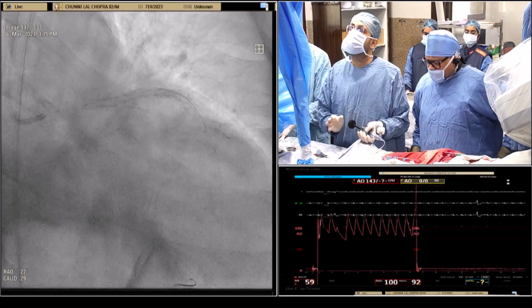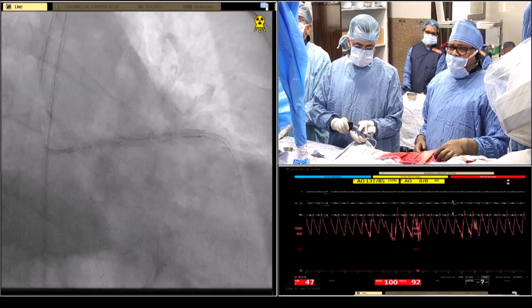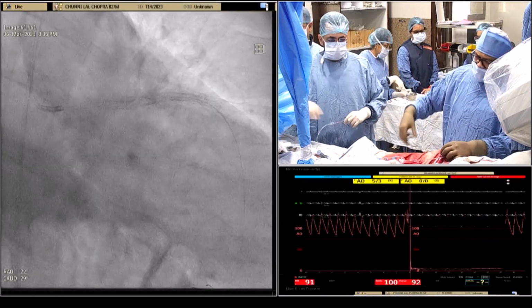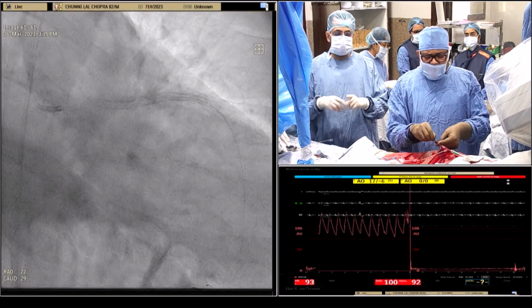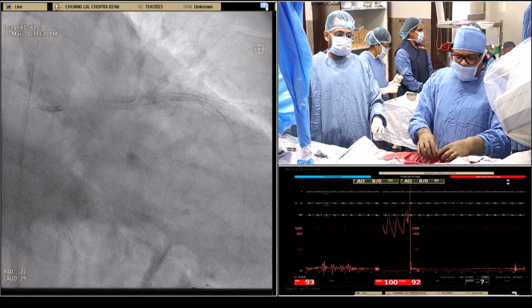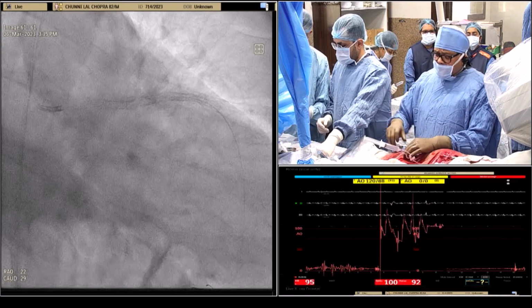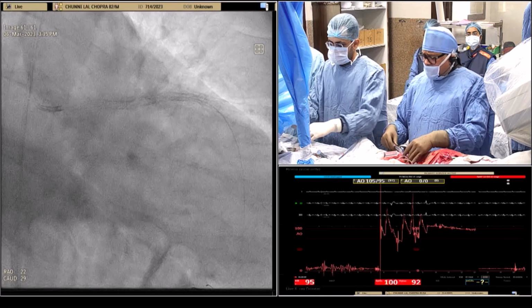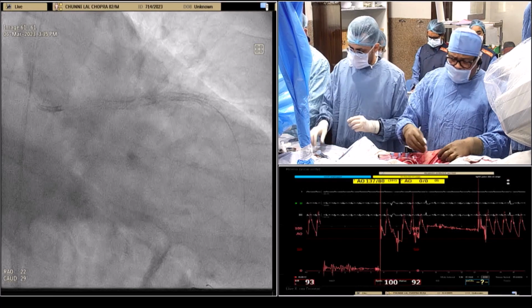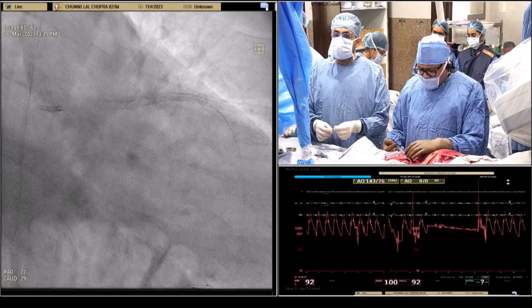Can you put a stent boost across it? Okay, we are within the stent. Go ahead. 12, 12, 14, 14, 18, negative. So we have post dilated the stented segment with a 3 millimeter balloon distally for a reference vessel of 2.9, and then 3.5 proximally from the origin of the diagonal, and then from the aneurysmal segment it's 4 millimeter, hence we dilated with a 4 millimeter.